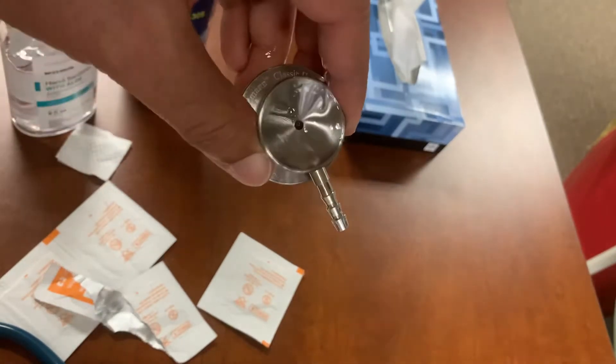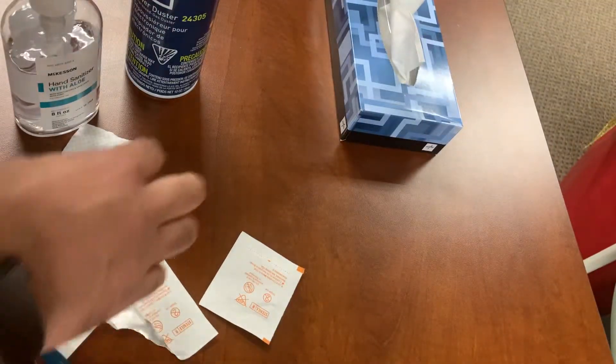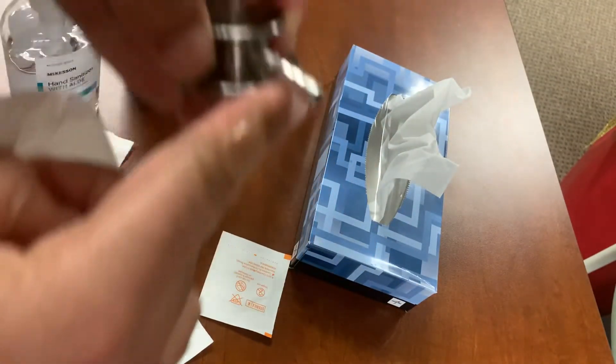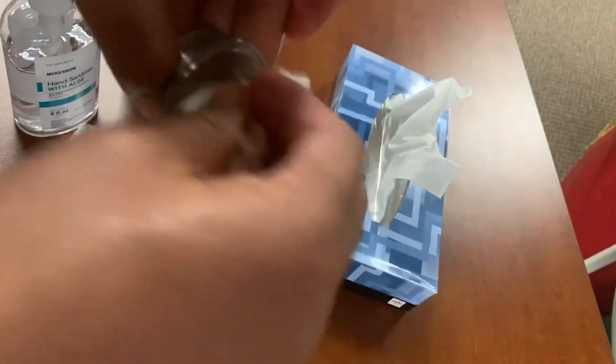The last problem is I got all this gunk in here — all this hand sanitizer, and it's going to take a while to dry. So you can just wipe it off real good with a tissue, wipe off the excess stuff, but then you remember you have some inside this little hole here. So wipe it all off.